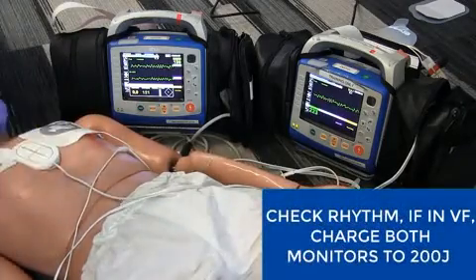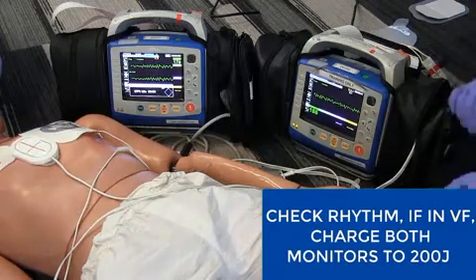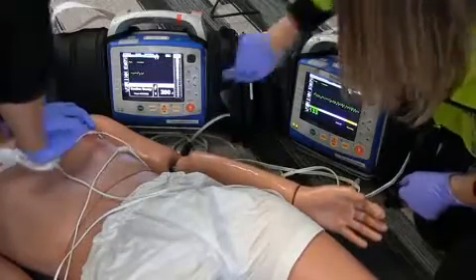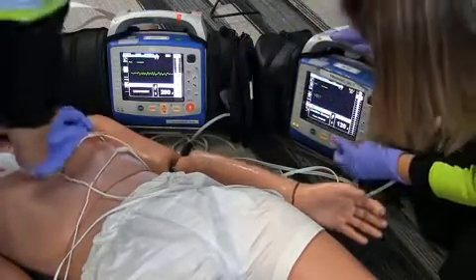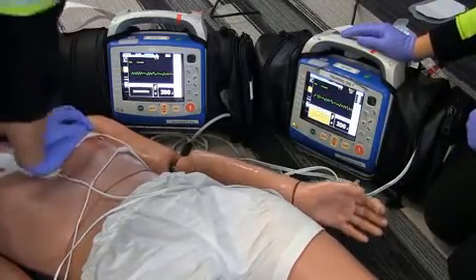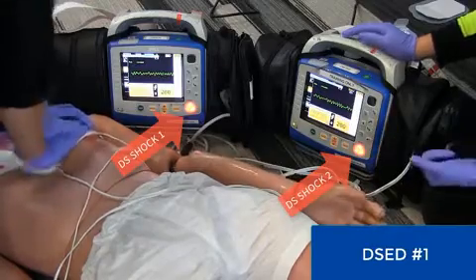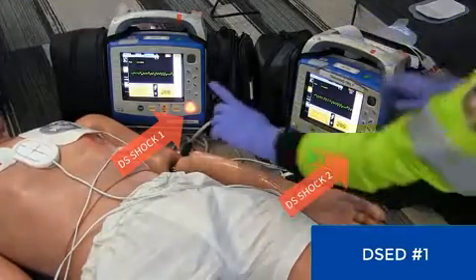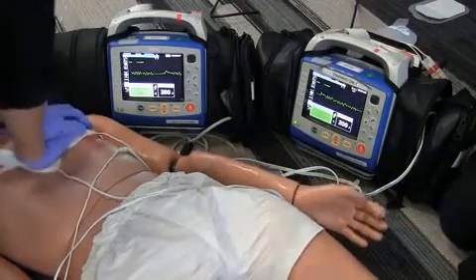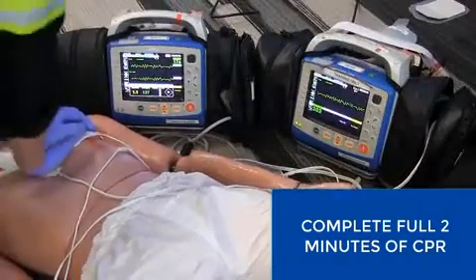Okay, stop CPR. Analyze. The patient is still in VF. The first double sequential is going to be done. Continue CPR. Charge both monitors to 200. Okay, stop CPR. I'm clear. You're clear. Everybody's clear. Shock one. Shock two. Continue CPR. Complete the full two-minute CPR cycle.